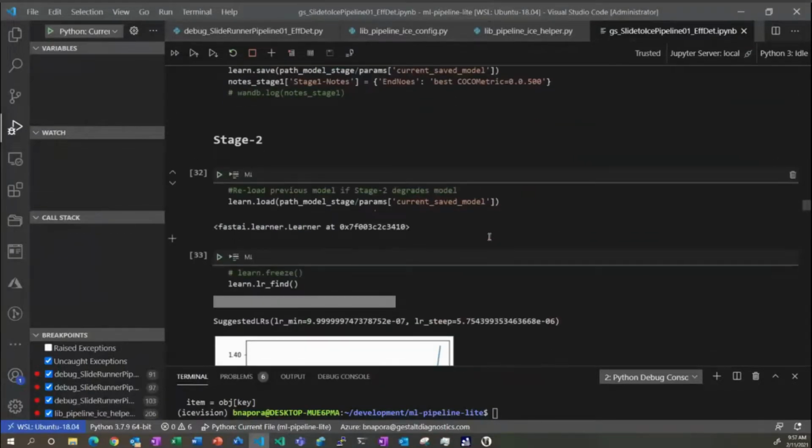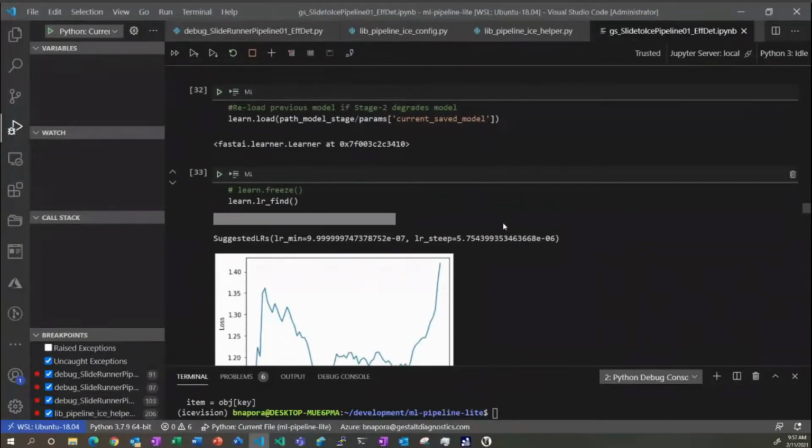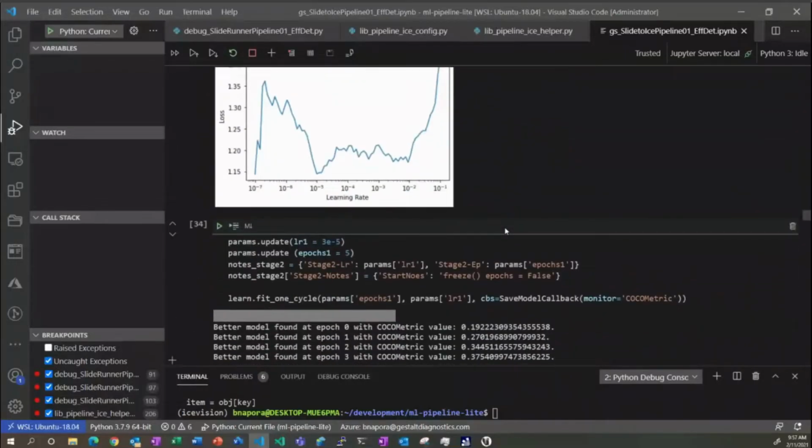And the rest of this, you guys have probably forgotten more than I know about the art of tuning a model. I'm still a relative neophyte in tuning, but getting better in this particular pipeline.